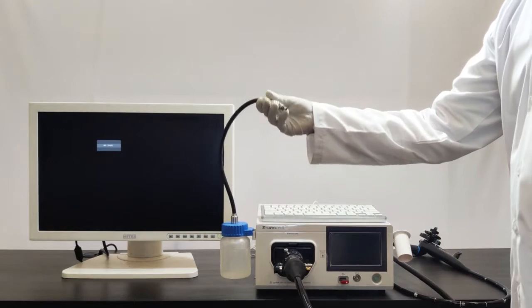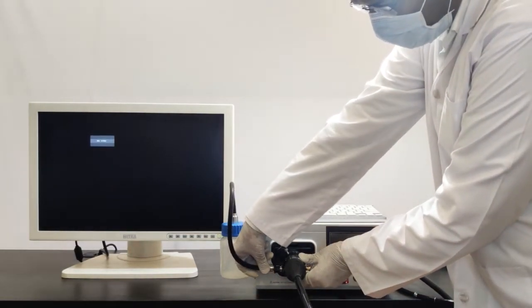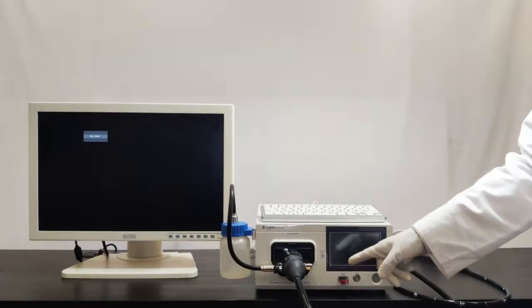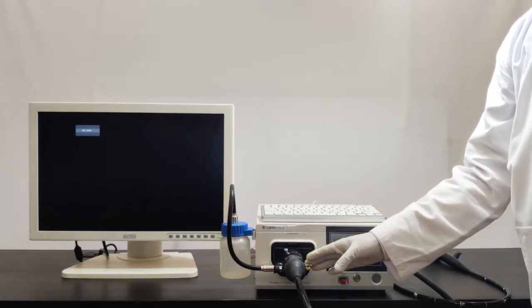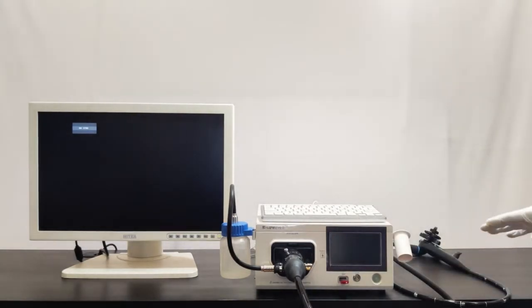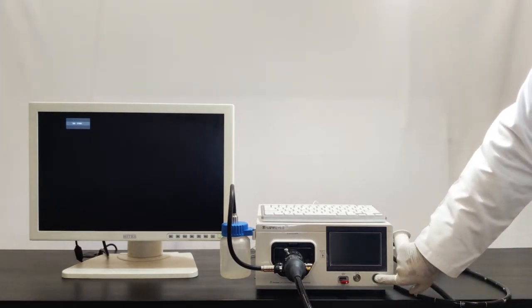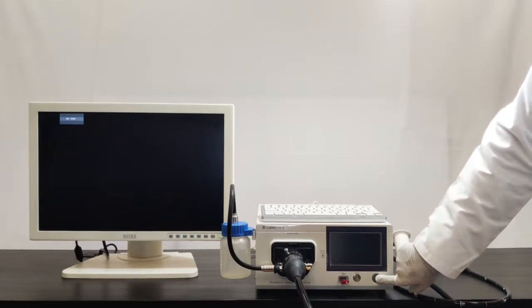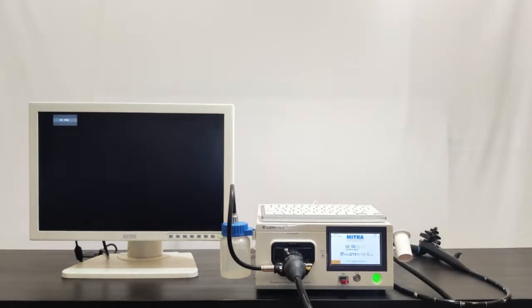I am connecting the water container to the water port. You can also connect suction tubing here. We will see the scope connections later on. First, I am starting this video processor — this is the power on/off switch, and I am pressing this button to start the video processor.